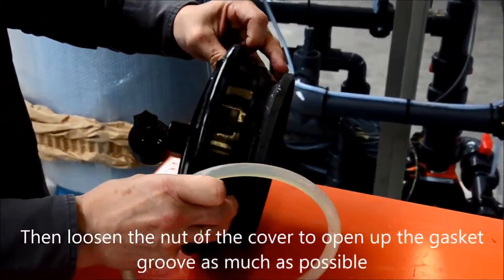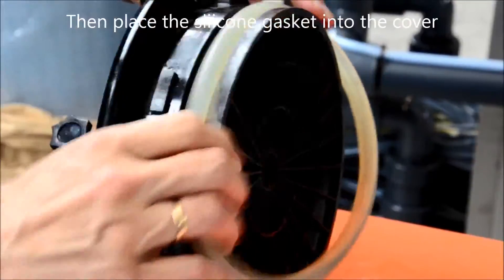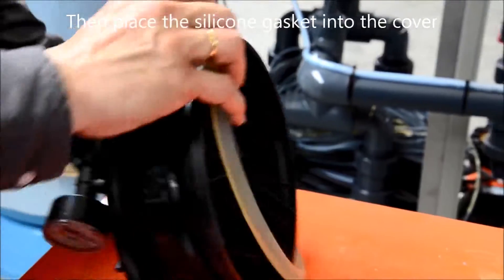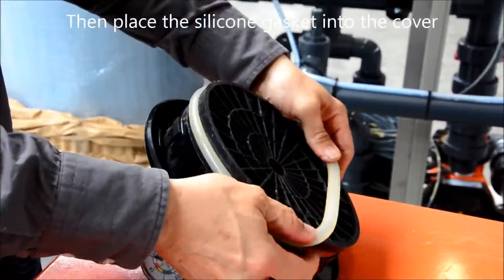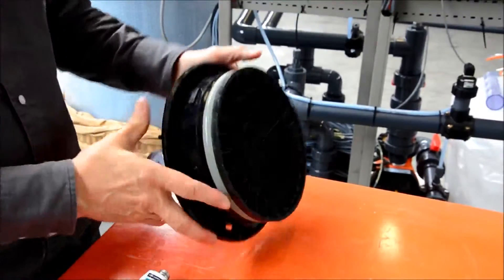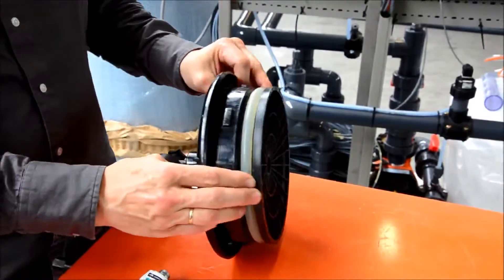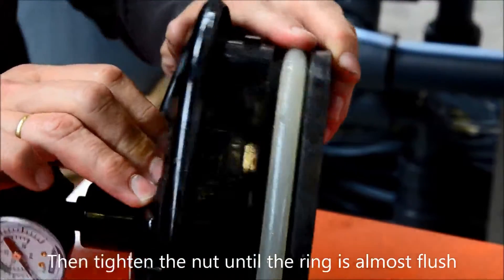Then loosen the nut of the cover to open the gasket groove as much as possible. Then work the silicone o-ring into the groove. Now tighten the nut until the o-ring is almost flush with the outside of the cover.